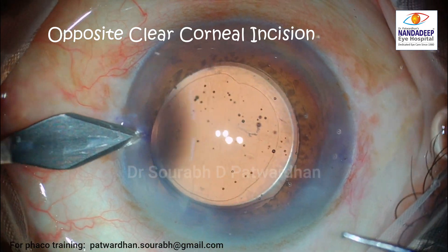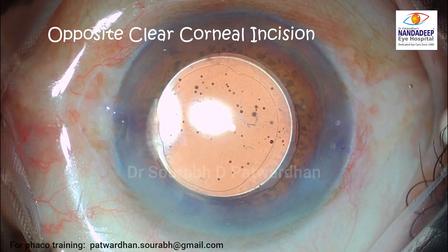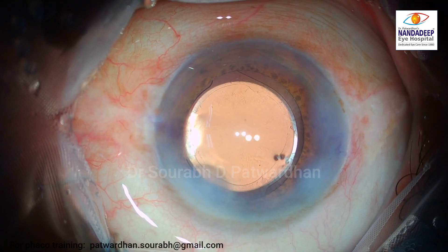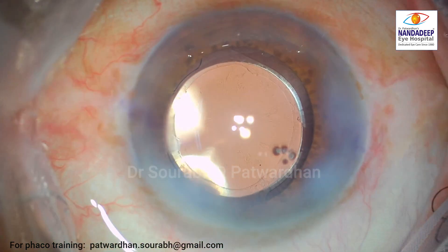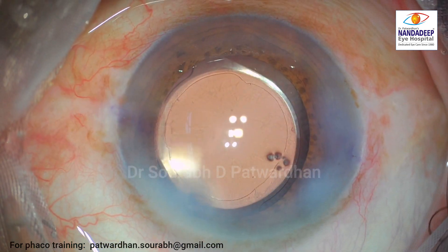At the end, I just nudge the IOL out. This is the opposite clear corneal incision to take care of the 0.75 diopter against-the-rule astigmatism that the patient had. And that just finishes this wonderful surgery with all those finishing touches.